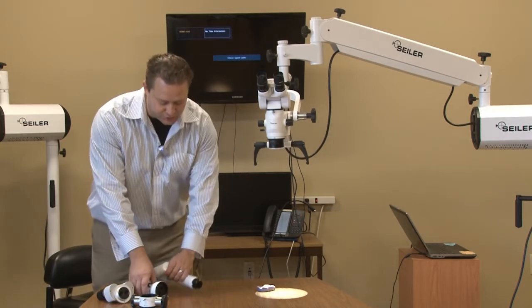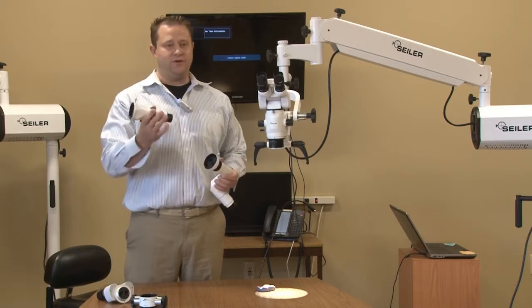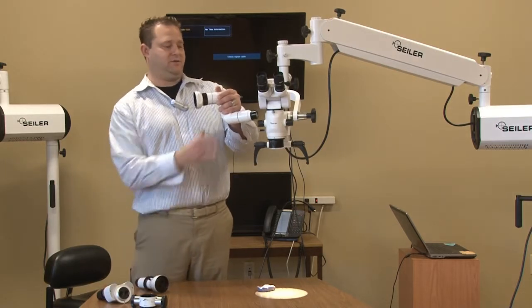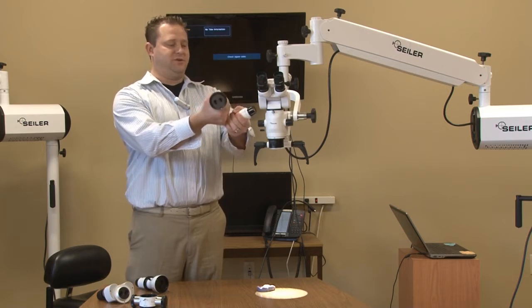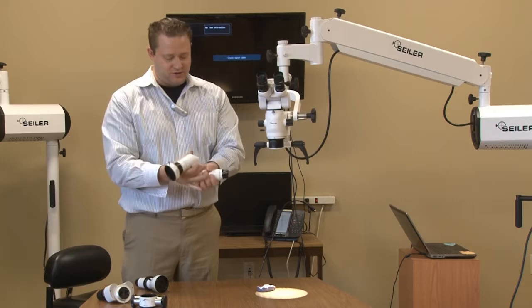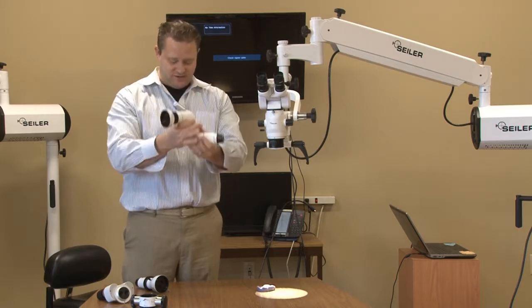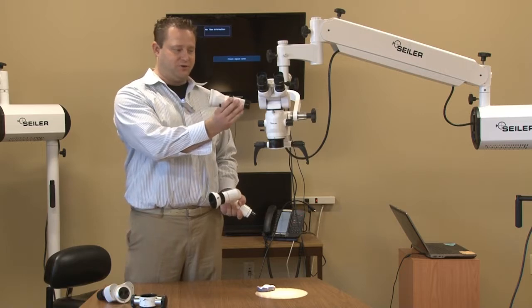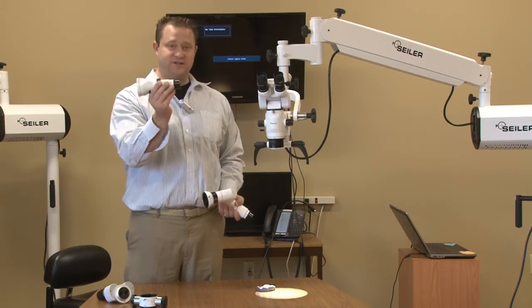We have two different couplers: a straight head and a 3D head, which is going to give you a lot more versatility. I'm going to go ahead and show you the 3D, but remember the straight tube coupler works the same exact way as far as the attachments.